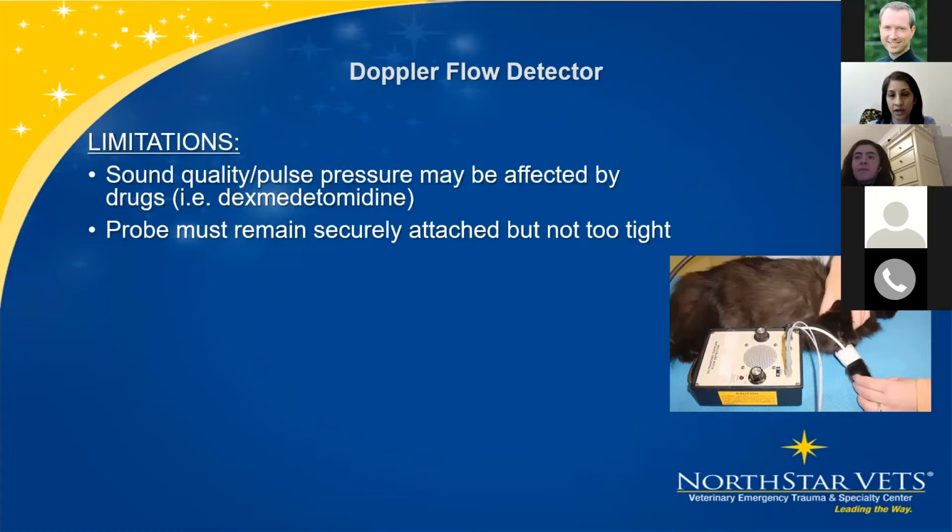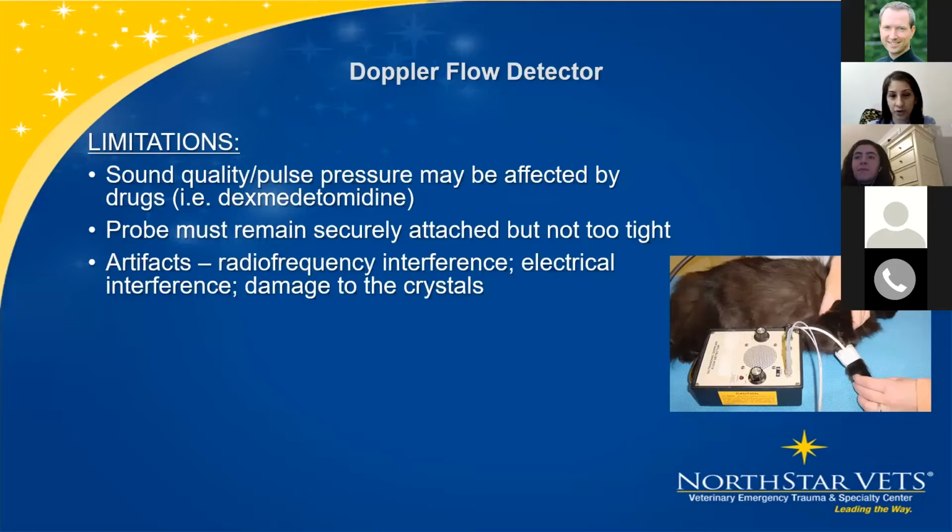And so it may return and it may sound great again, or it may take a little bit of time to improve. It's also somewhat of an art to attach that probe to the animal. It has to be securely attached, but not too tight. Just the right amount of gel. Otherwise, sometimes it can slip right off.